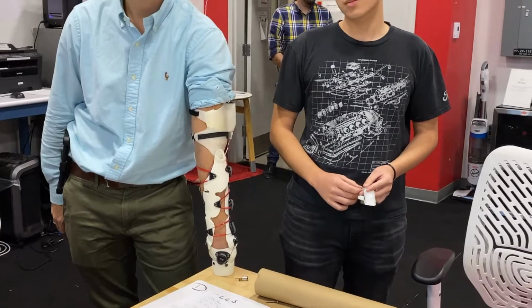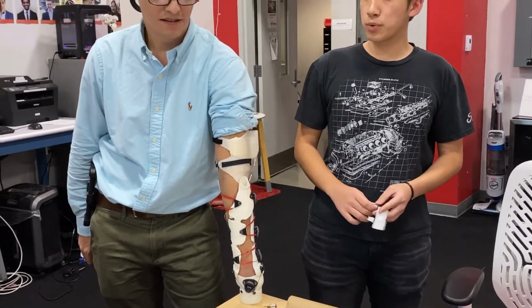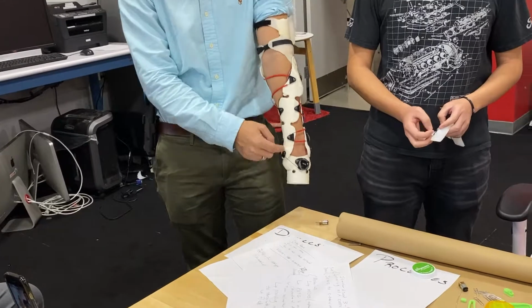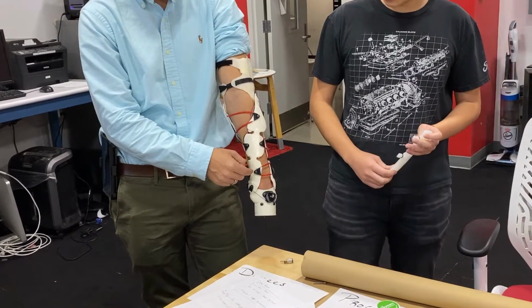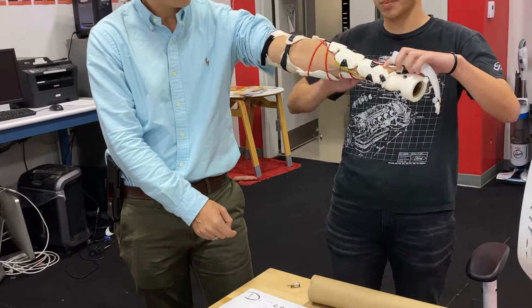That's specifically for nylon. No, we have not. Helps a lot. But for support with the nylon parts, we use PVA, and that works very, very well. So the flexible portion, though, how's that printed? We used PLA for support for the flexible parts, and they're printed flat like this on the print bed.